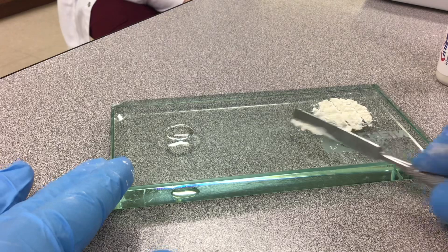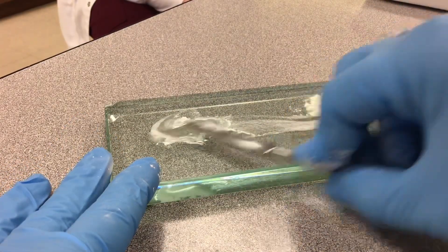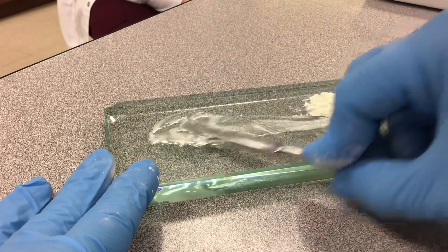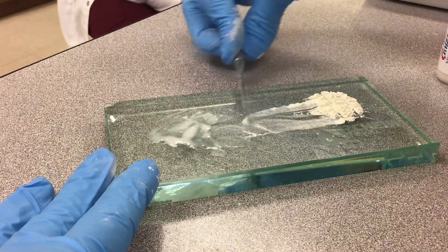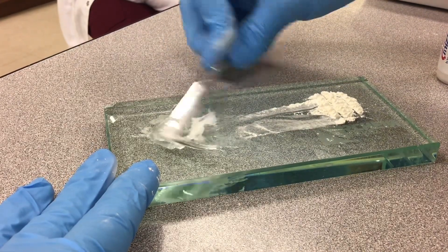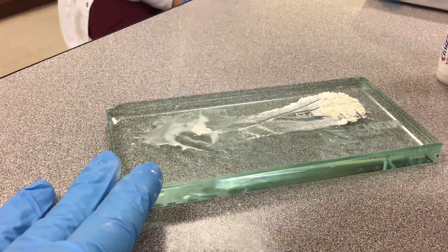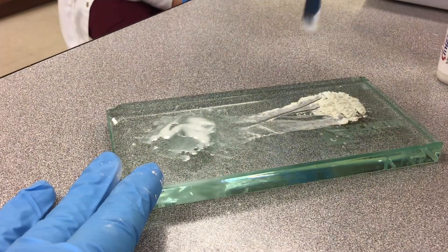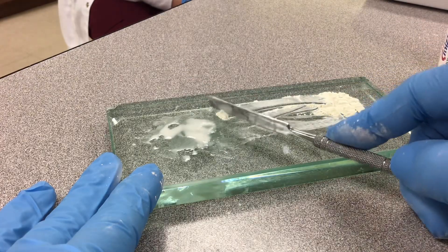So you're going to scoop a little tiny bit into your liquid and then mix it over a large area. A little tiny more and mix it in a large area again. A little bit more into a large area, and a little bit more into a large area.